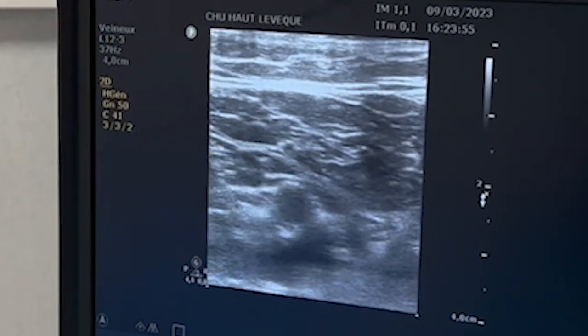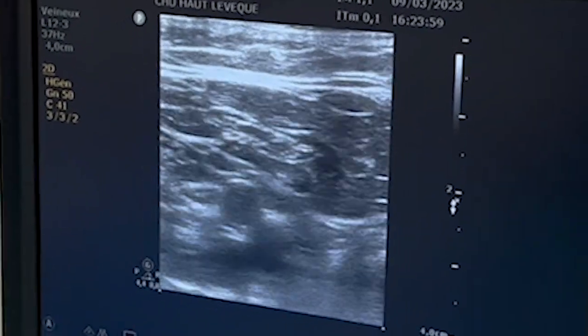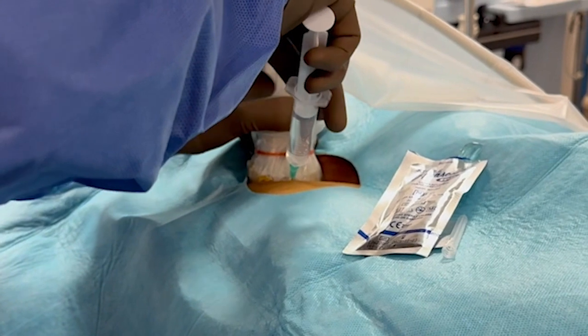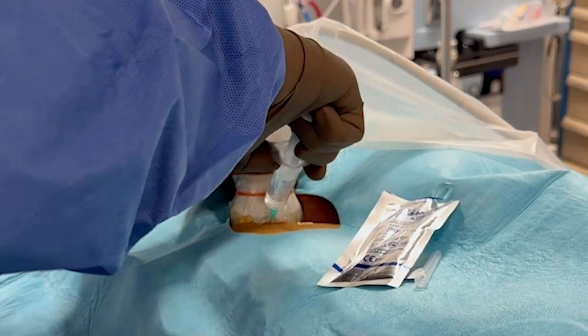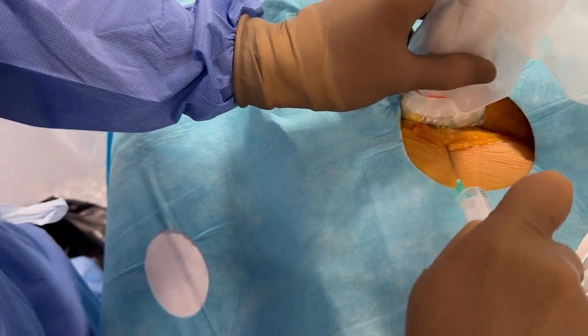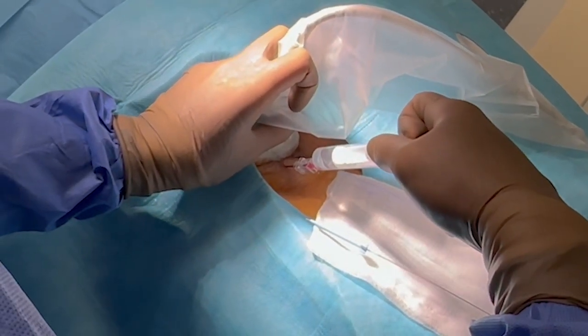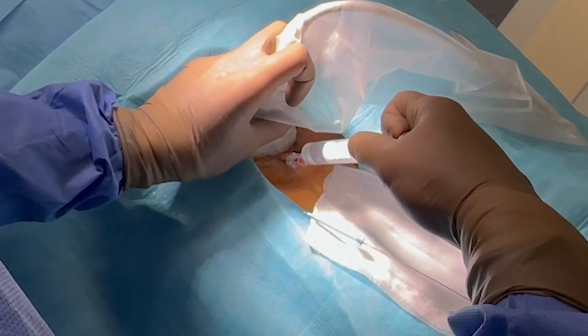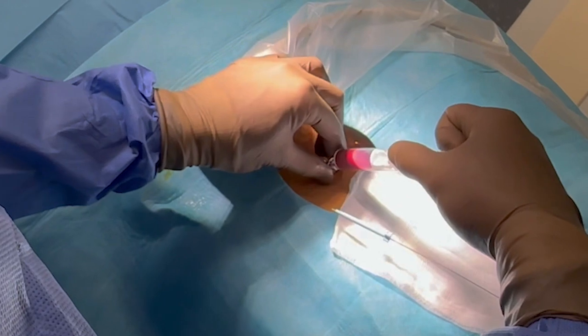Notice how the femoral vein collapses when applying pressure with the probe. Local anesthesia is injected between the skin and the femoral vein under echographic guidance. It is important to make sure there is ample venous blood return before advancing the guide wire.